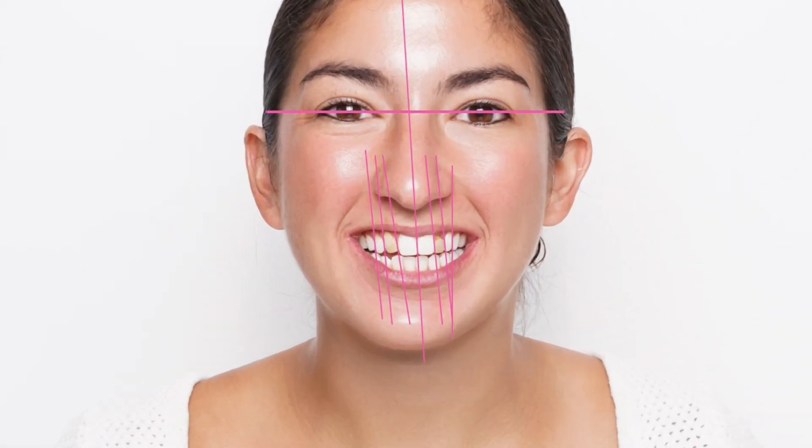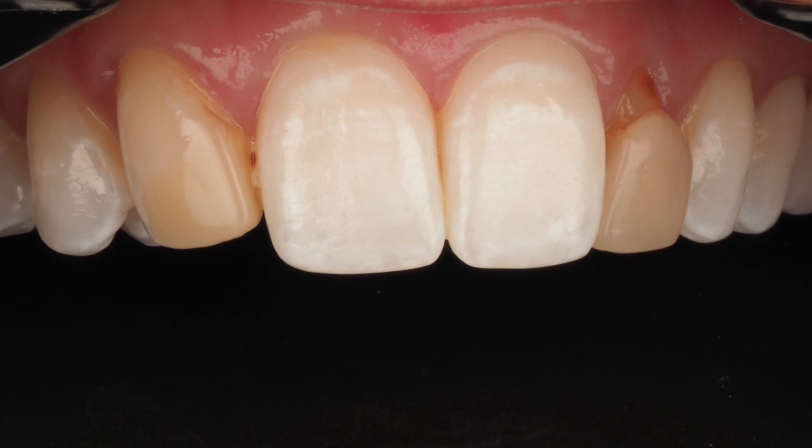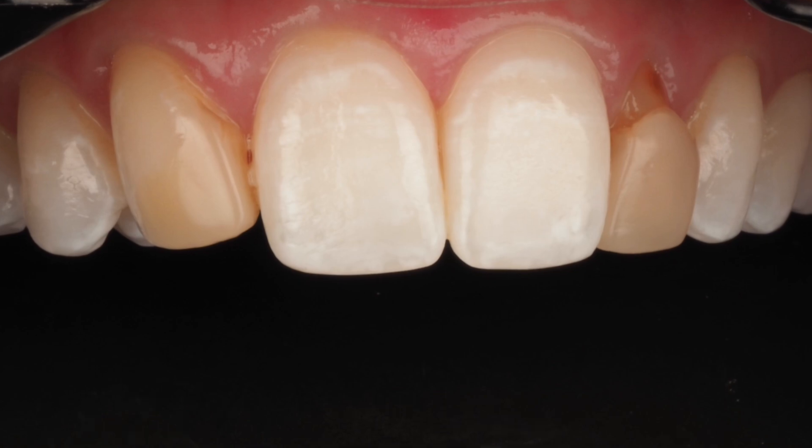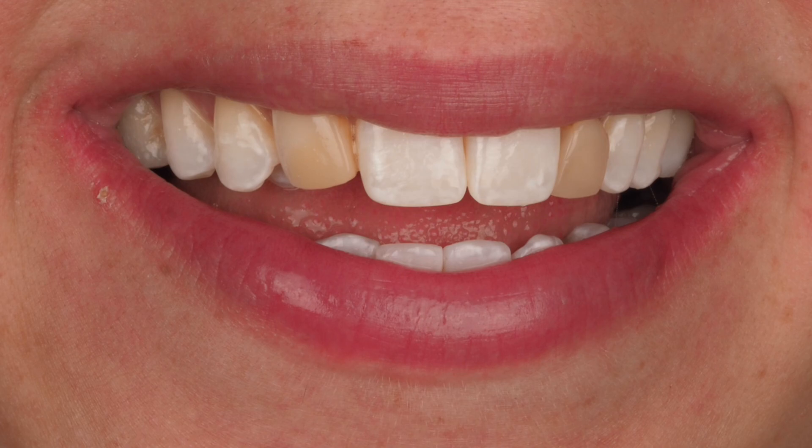One thing I'd like to point out is that we have some midline cant here, roughly 5 degrees. The midline is shifted over to the patient's left. We have a tooth size discrepancy with a cuspid in site number 7 and a primary retained tooth G in site number 10, and of course size discrepancies there. We also have premolars moved into cuspid positions, so we have a lot to correct with veneers.